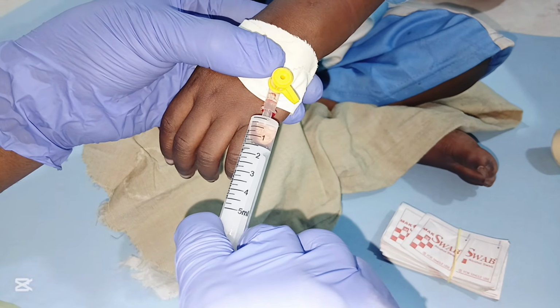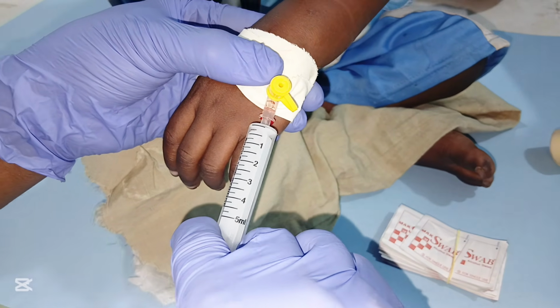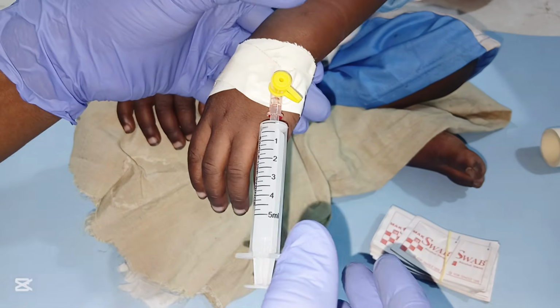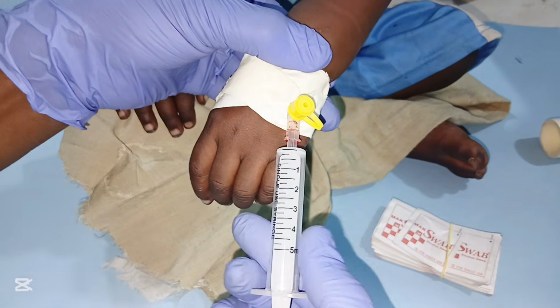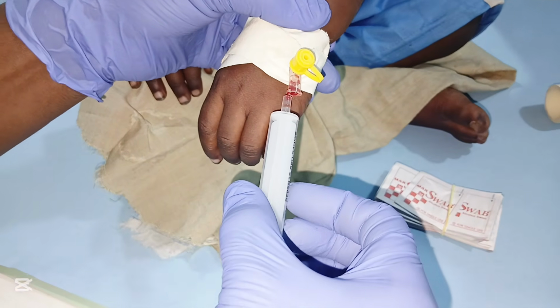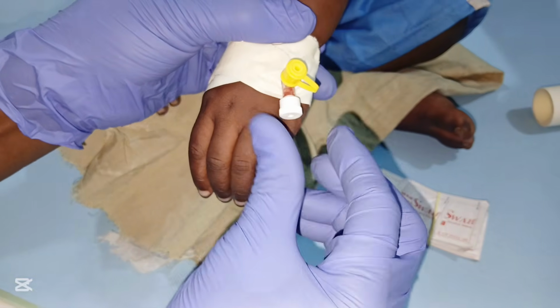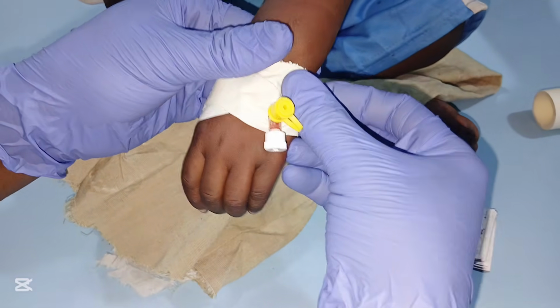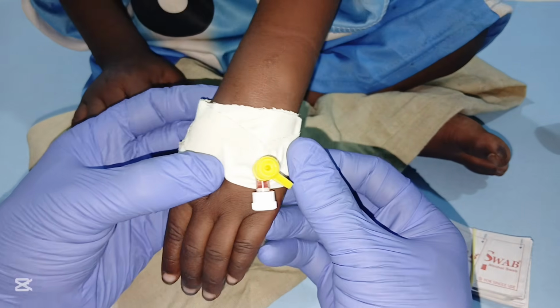So this is how you are going to perform pediatric IV insertion technique. When you finish, make sure you apply pressure on the tip of the vein to control bleeding. You remove the syringe from the cannula. Make sure you cap the cannula. So this is how you are going to perform pediatric IV insertion technique.